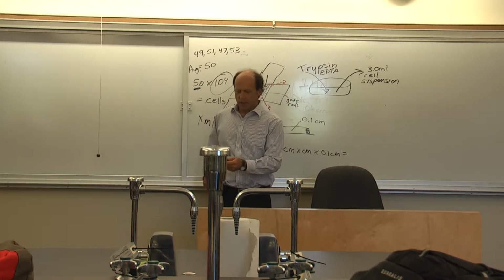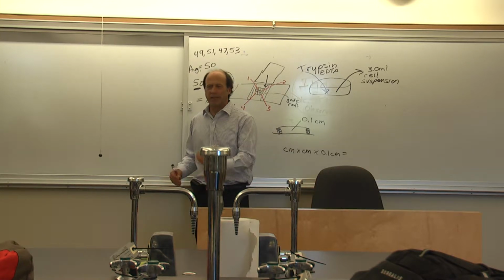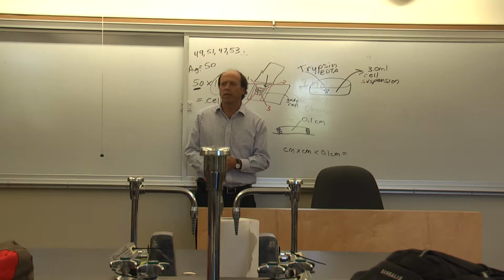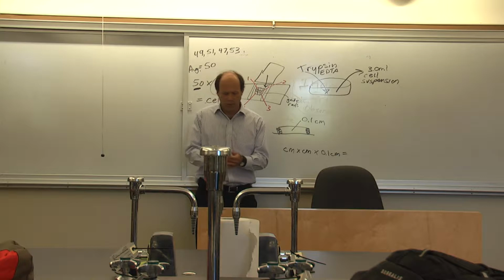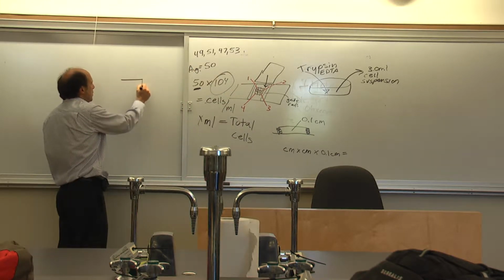Cell phone, the current version, and then next year there's another version of the cell phone, and it does a little bit more. Well, that's the way some of the instrumentation is in the lab too. It keeps evolving and changing. We have a particular version of an electronic cell counter. It's made by a company called Coulter, so it's a black box.